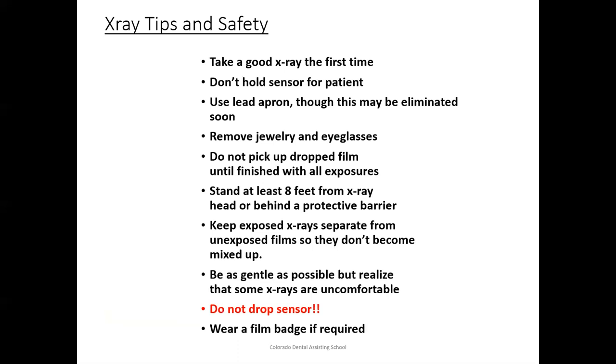We have a video on our student portal that gives tips and tricks on how to hold on to that sensor. So that way, even if it falls off of the RINN, or for some reason it just slides out of your hand because your fingers are slippery from saliva, you'll still have the cord in your hand, so you won't drop it. So please, once you're done here, go back and watch that lab video on how to make sure that you don't end up dropping the sensor.